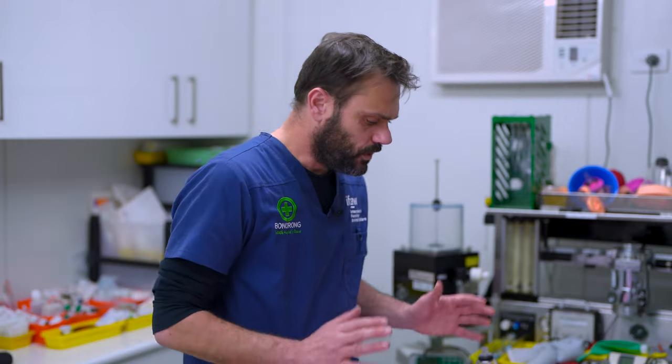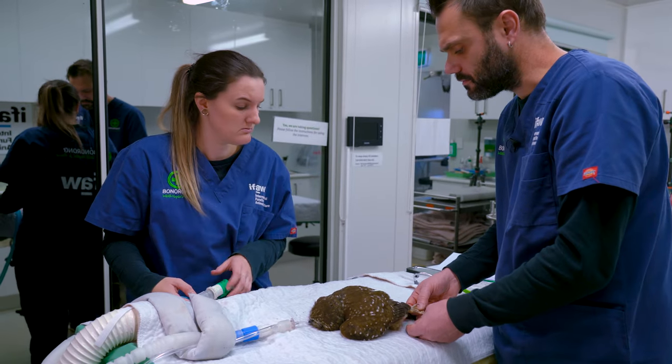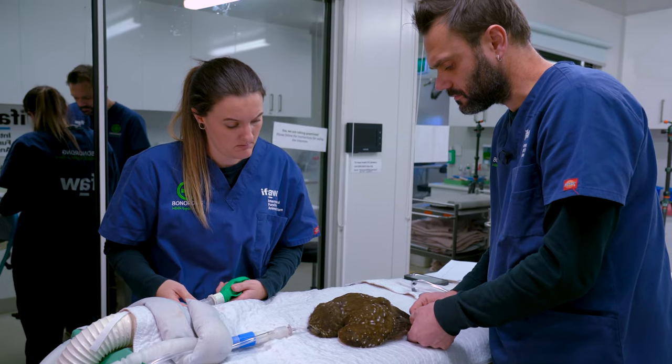During anesthesia we will IPPV the birds throughout — one breath every 15 seconds or so, even if they are breathing, just because sometimes they can stop breathing with no warning. Once the bird is induced and relaxed, you can intubate.